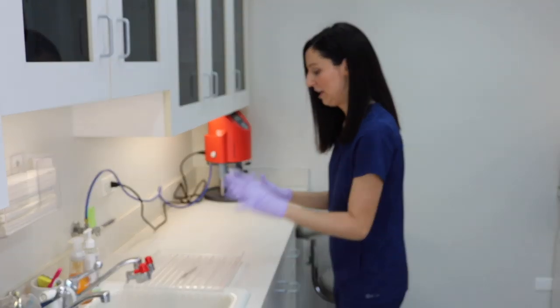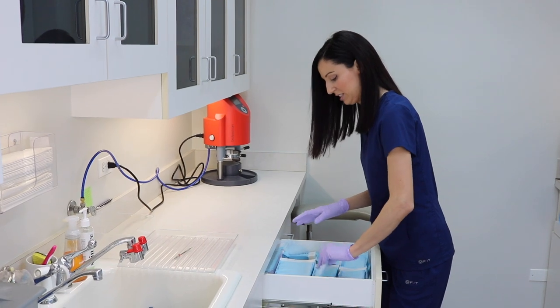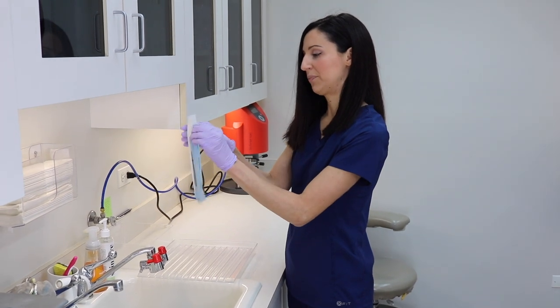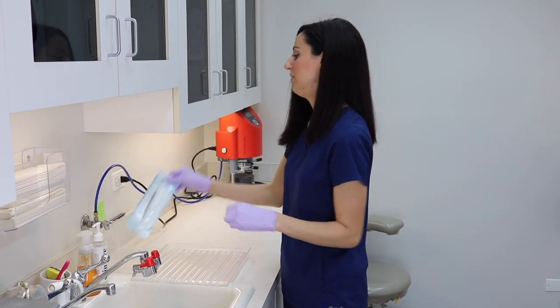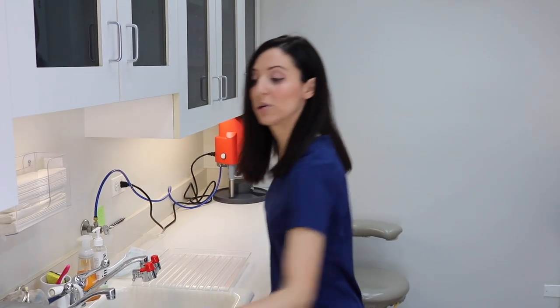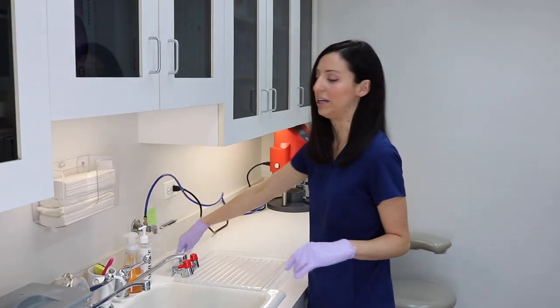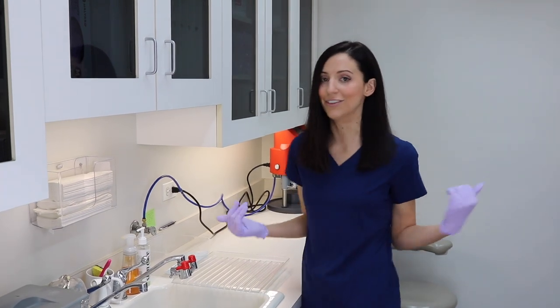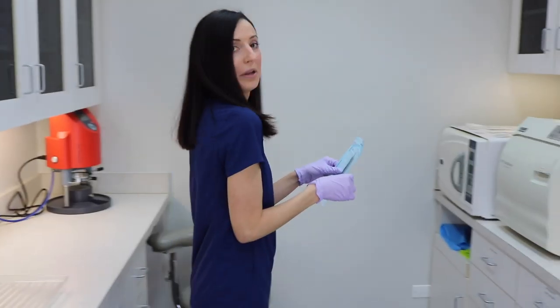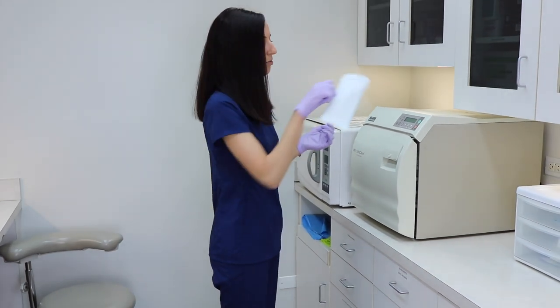Remember, everything on this side is dirty. We have a drawer of different size sterilization pouches. You take your dirty instrument, put it into the pouch, close it, and place it in this little bin over here. Once the bin gets full, you load it into the autoclave — though some people put instruments straight into the autoclave.